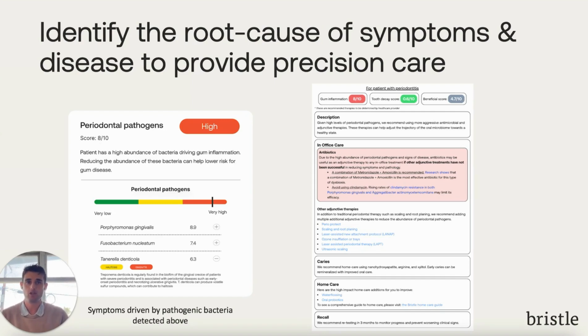The majority of patients will present with at-risk or high-risk scores, usually above a score of 6.5. However, it's possible your patient presents with low scores despite having symptoms, which can indicate other issues.